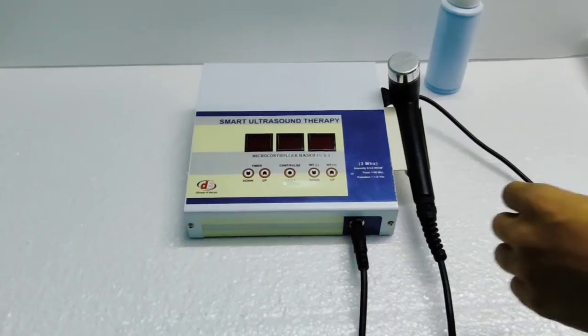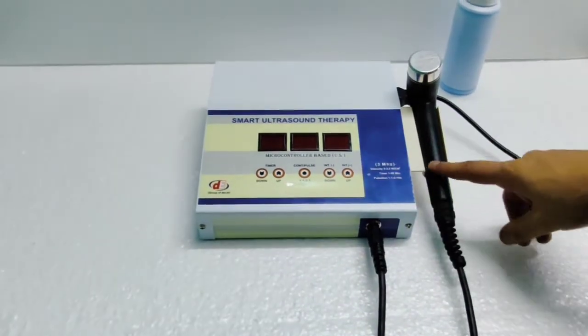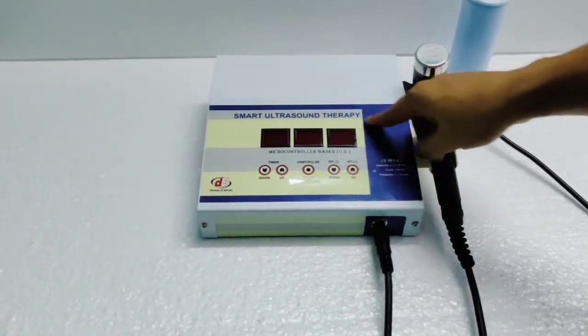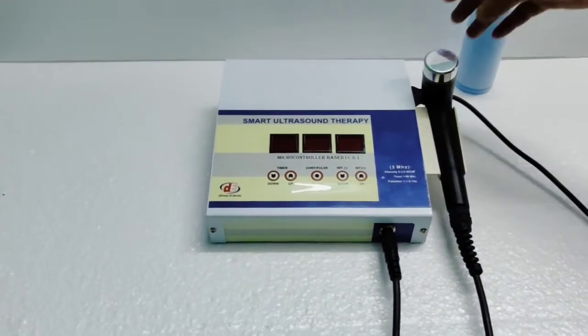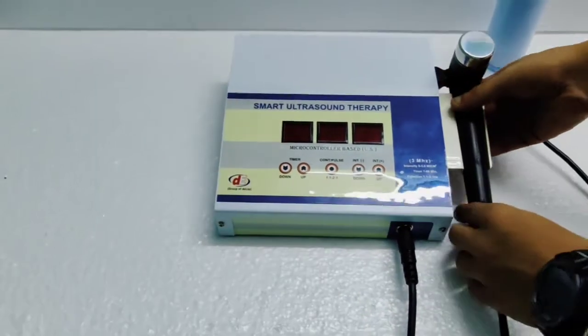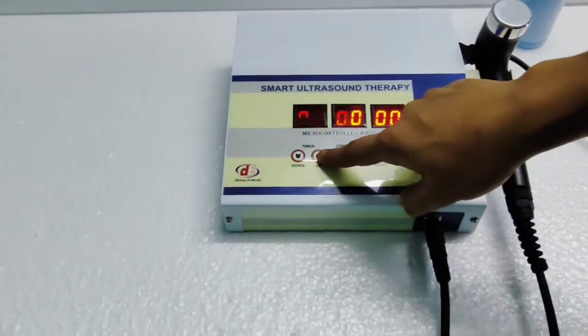Hello everyone, this is three megahertz ultrasound therapy and today I'm going to show you how to use a three megahertz ultrasound therapy machine for pain relief. So let's get started. First, turn on the machine and increase the timer.